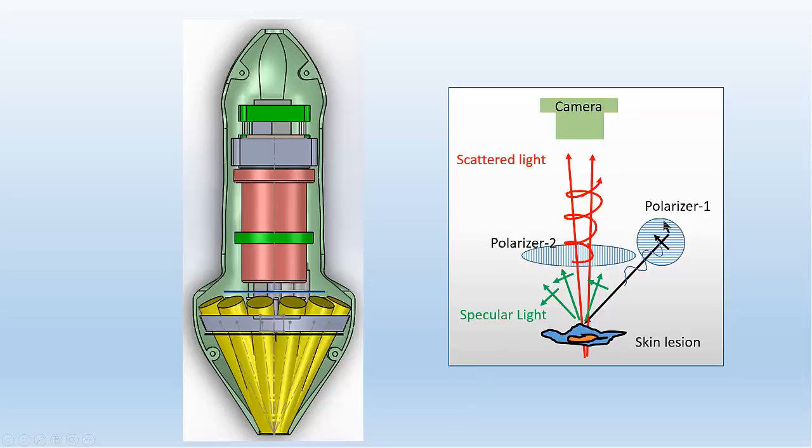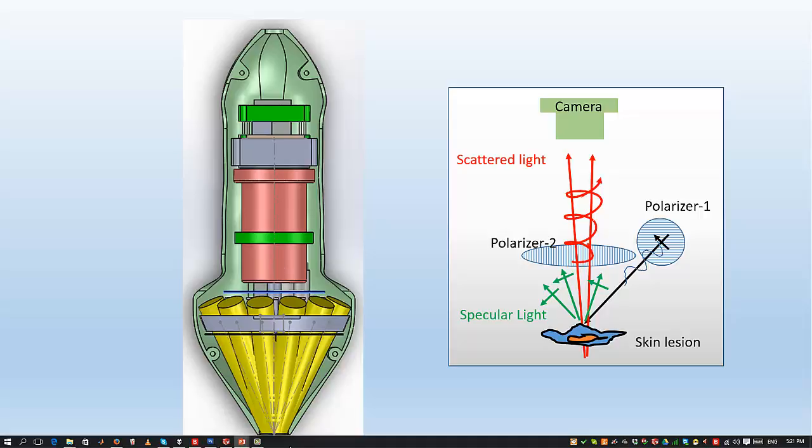So again, we have a polarizer and transmitted light. Here it is over here. We have another polarizer that blocks the specular light. It's somewhere here, and then from here to the camera we have this light path that's marked here in gray. Let's see how it looks.